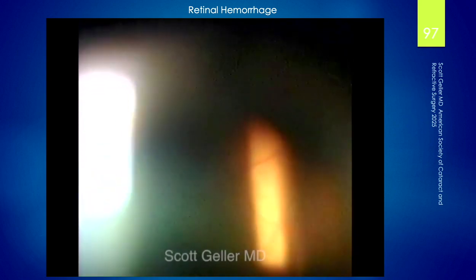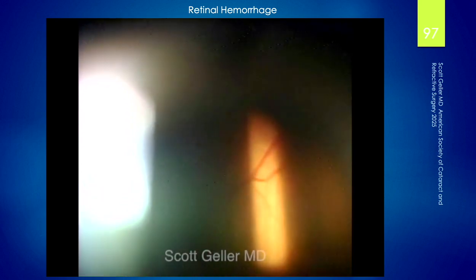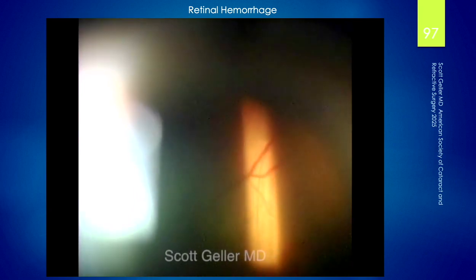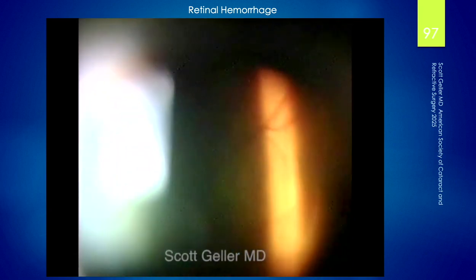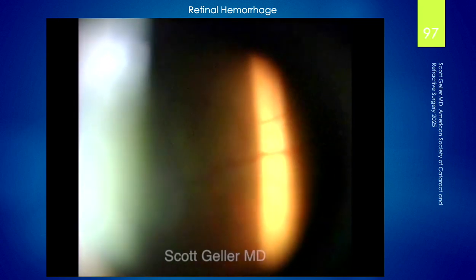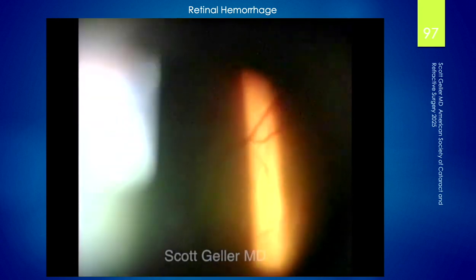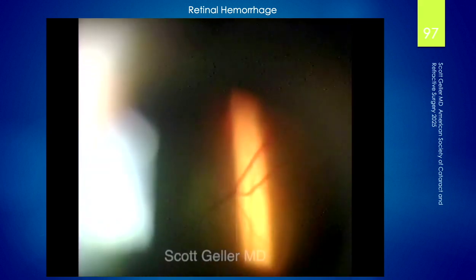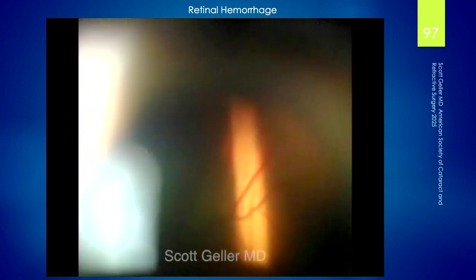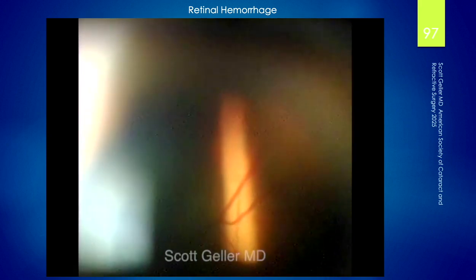I looked at him at the slit lamp again. I told him to stick around, brought him out to the slit lamps, and looked at it gently with the contact glass. And they looked the same. And I knew this would heal up. Saw them in a day or two. Patient never noticed anything. And I said, we'll get the floater. Just let's wait a week or so.